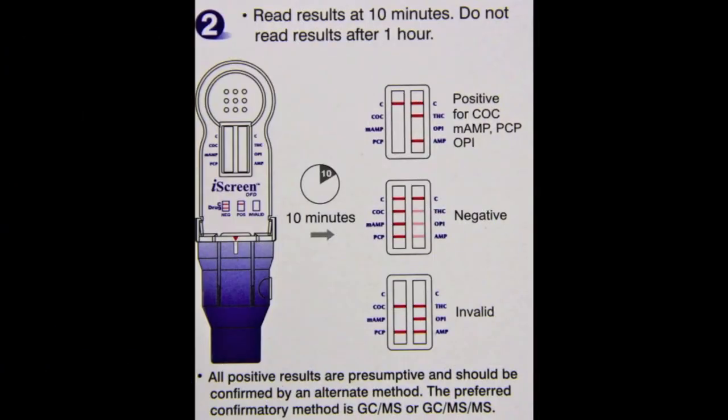Finally, you can read the results after 10 minutes but not after 1 hour. If you'll notice, the first set of results show a positive for cocaine, methamphetamines, phencyclidine, and opiates.